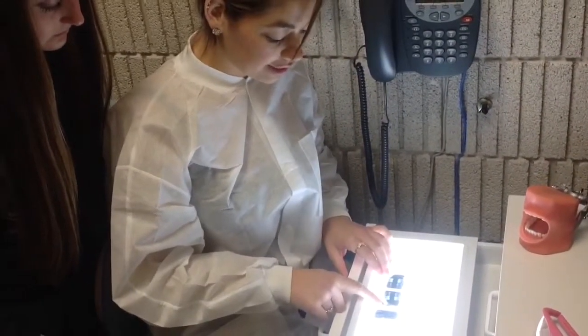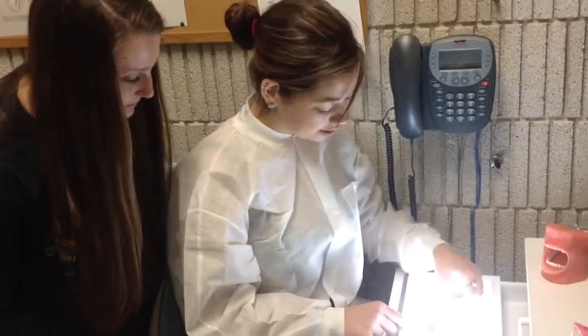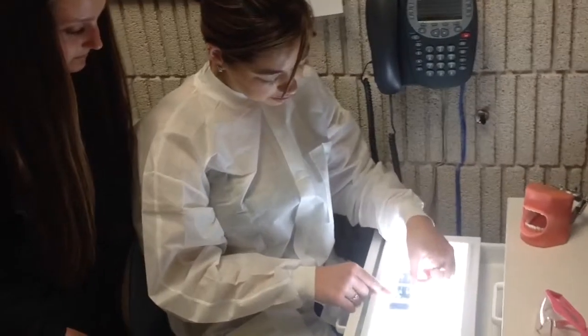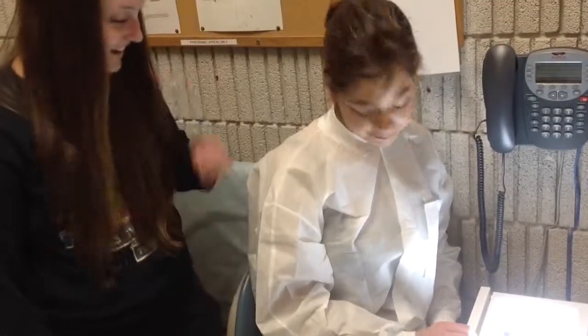And actually, if you look right here, this is one of your molars that hasn't erupted yet. So you can see your teeth and they're not even in your mouth yet. Wow. Pretty cool, huh? And you also see these little white spots up here. Those are your adult teeth, and those are pushing your baby teeth out. Pretty cool, huh? Yeah, that is cool.